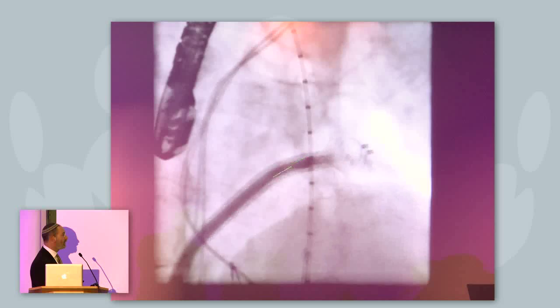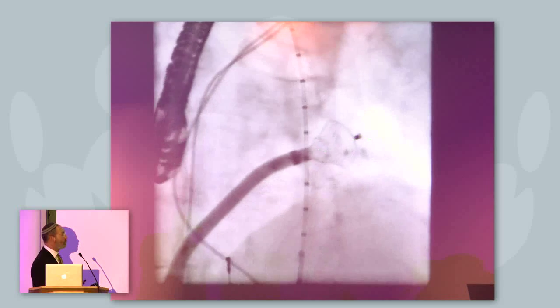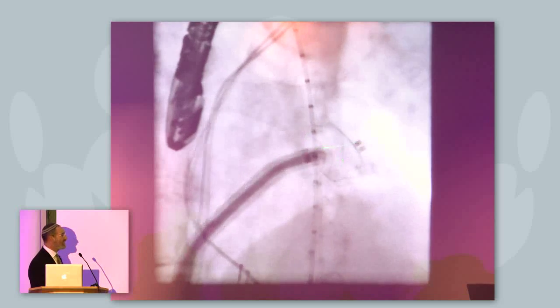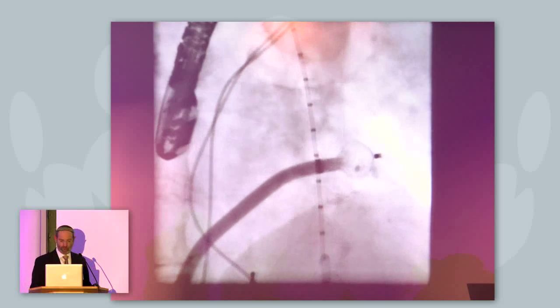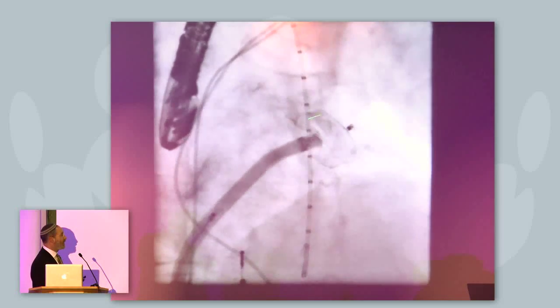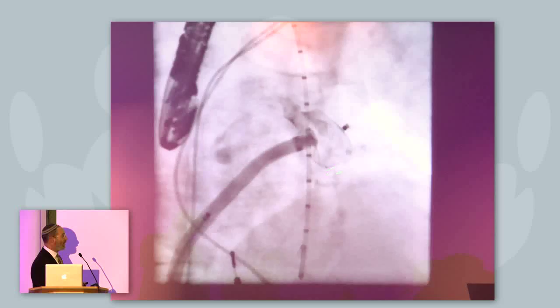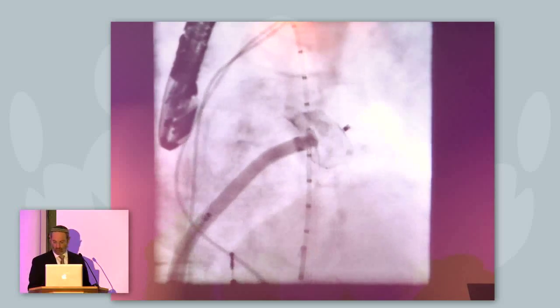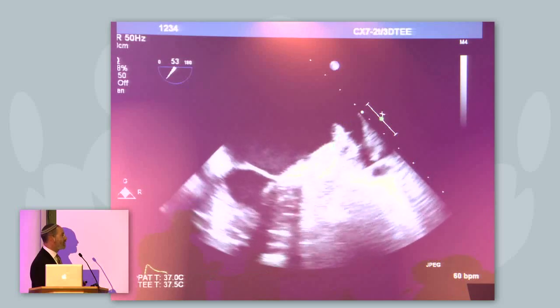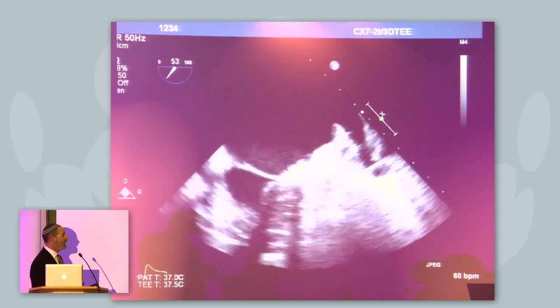Now we're going to go to point 3. At this point, I hold the sheath stiff and I push the device forward. It opens out sideways and assumes its position. It does not go forward. It only opens out sideways. Once I've achieved that, I can check my position. I see the apposition over here, how far I'm in. I can look at it by echo as well to see whether I'm sitting nicely, deep enough, where my circumflex is, whether the apposition at this side is adequate.